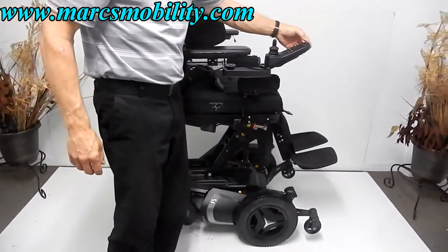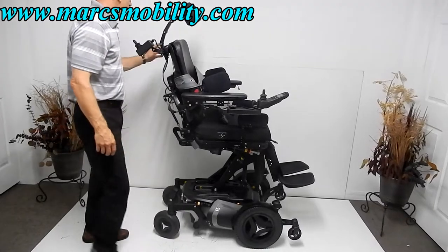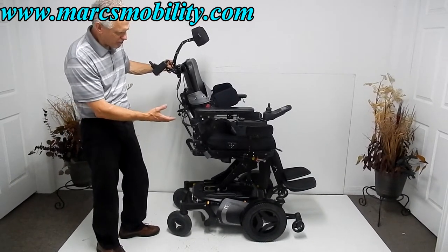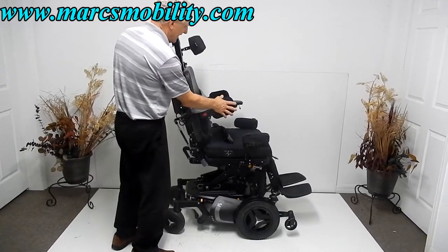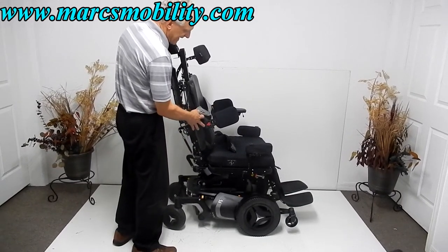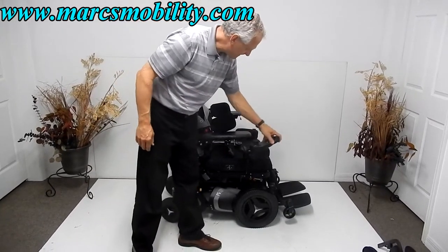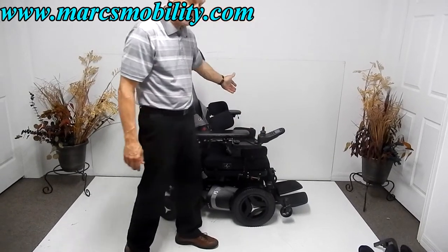That's the electric seat lift. Now I'm bringing the seat back down. The chair is also equipped with a safety belt and a Roho cushion on the seat. The arms are adjustable up and down for easy access. There's lateral support that can be moved away from the chest, taken off completely, or adjusted in and out. The joystick is a swing-away design and can be mounted on either the right or left side.